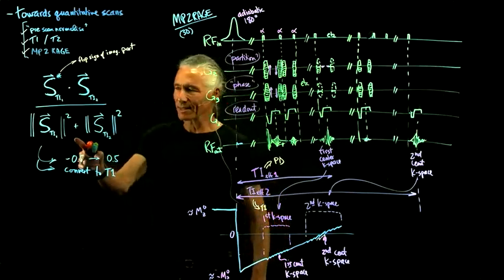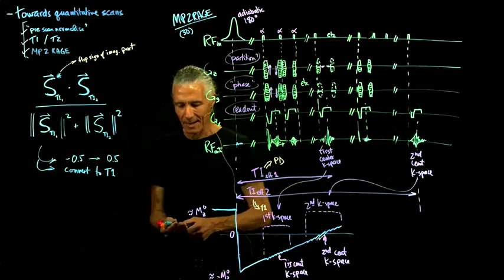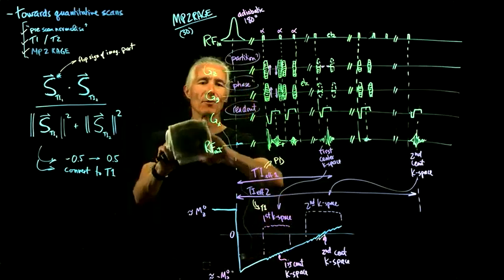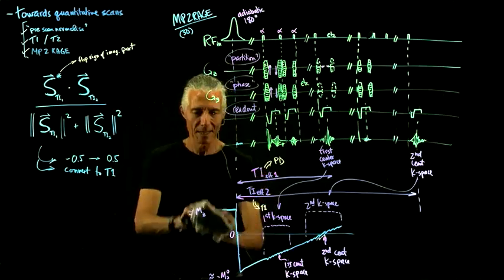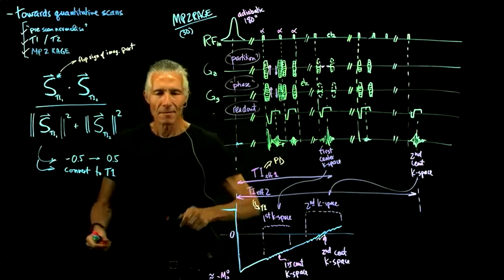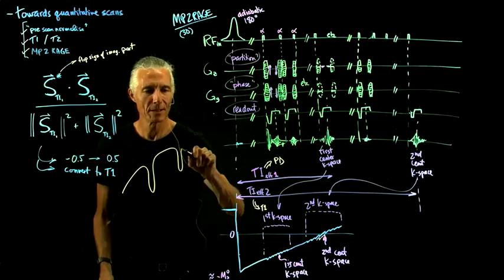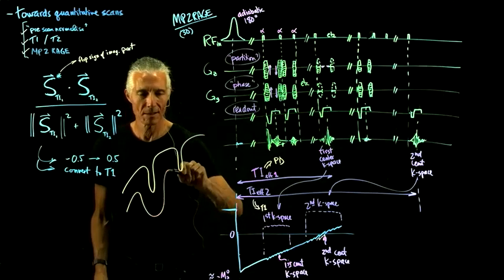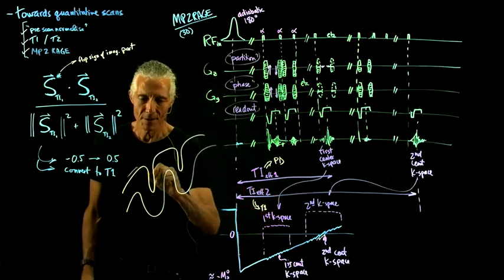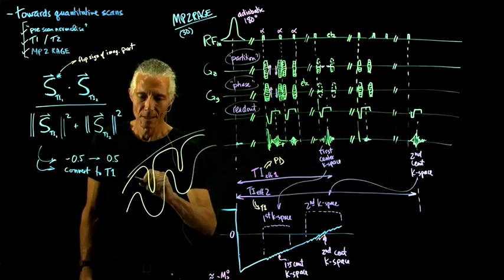So say we do this thing. One of the problems with this is that if we look at the cortex, so here's the cortex here. Cortex looks really good. Gray matter and the white matter look really good. And the dura is pretty good. That looks really good. And then we get up to the skull.